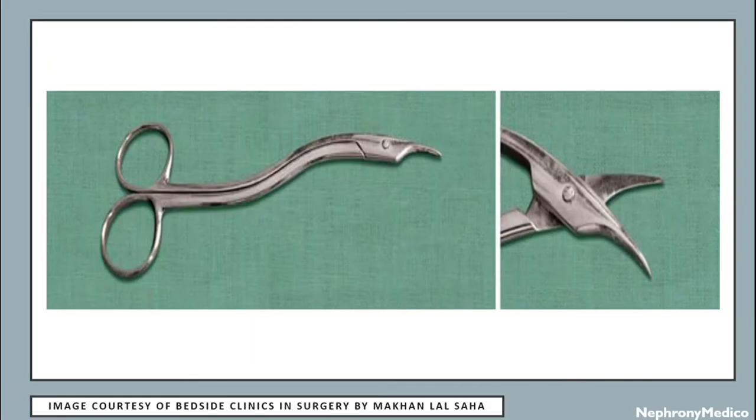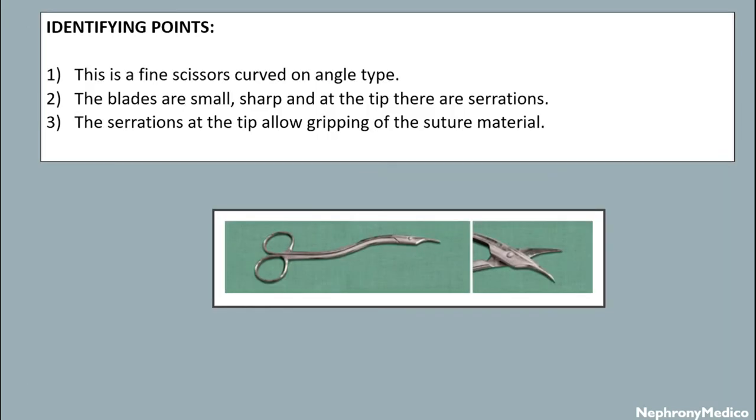Let's talk about Heath's suture cutting scissors. This is a fine scissors curved on flat type. The blades are small and sharp, and at the tip there are serrations. The serrations at the tip allow gripping of the suture material. It is used to cut the sutures on the skin or mucous surface. The serrations at the tip of the blade help in holding up the suture during removal.